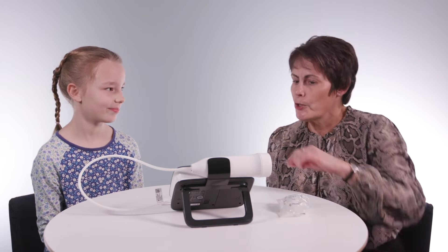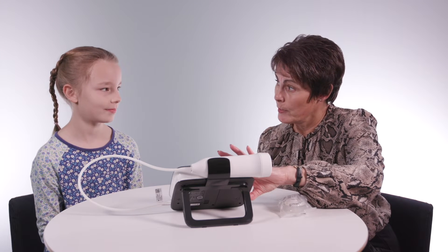So what I'm going to do is a breathing test with you today and this is called a FeNO test. It's quite easy to do and I'm going to talk you all the way through it, and it's going to involve you doing a little bit of breathing in and then some breathing out as well.